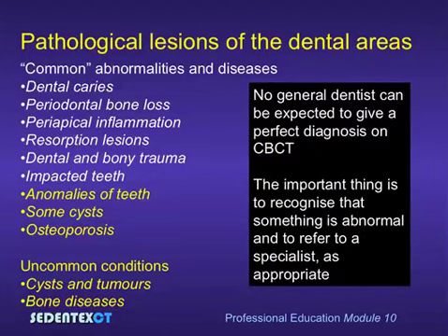Indeed, no general dentist can be expected to give a perfect diagnosis on cone beam CT of these uncommon conditions. The important thing is to recognize that something is abnormal and to refer the patient to a specialist as appropriate.